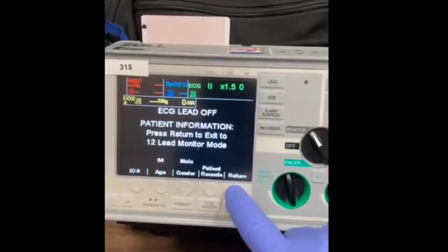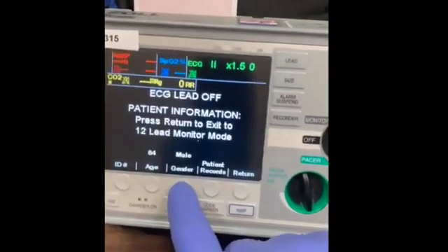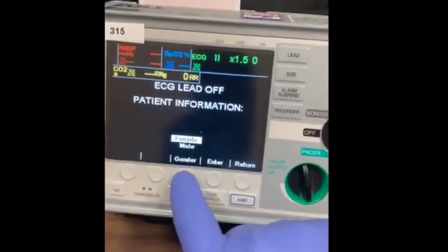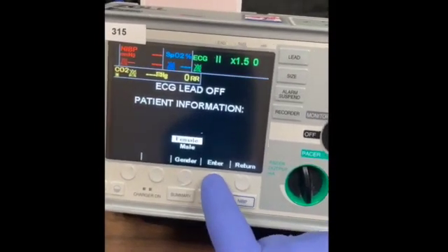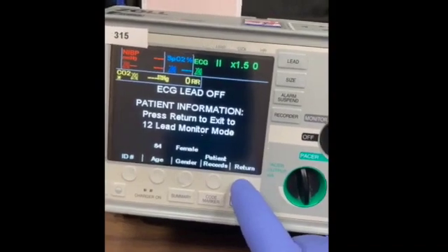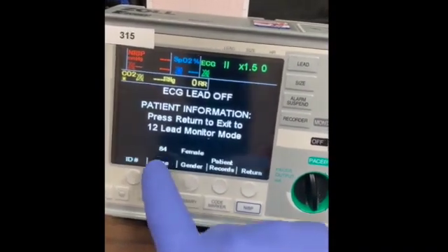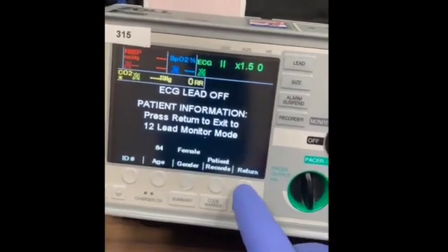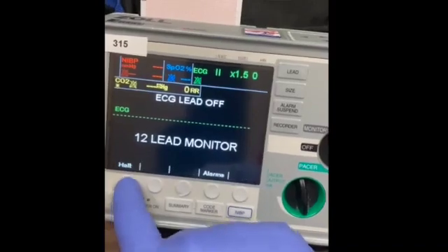After confirming the age, press return. 84 years old. Now select gender. For this example, we will be using female. Confirm. Return. Go to patient info. Confirm the age and the gender. Return. Select acquire.